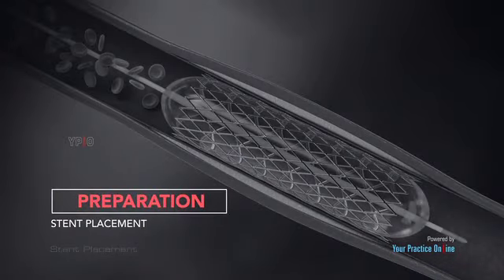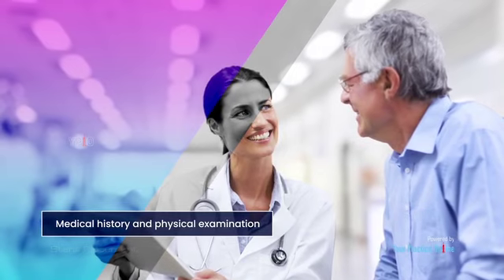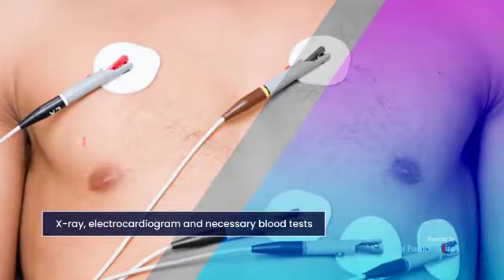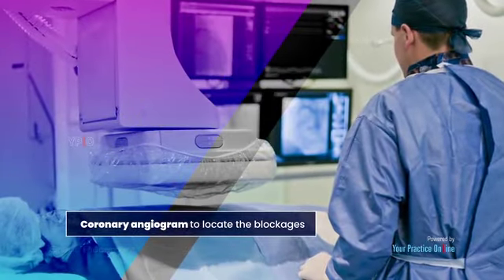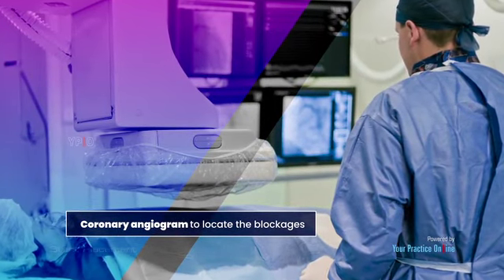Preparation. Prior to the procedure, your doctor will evaluate your medical history and perform a detailed physical examination. A chest X-ray, an electrocardiogram to record heart rate and electrical activity, and necessary blood tests may be carried out. Subsequently, an imaging test, coronary angiogram, to locate the blockages is also performed.